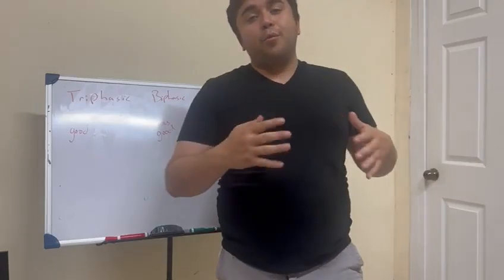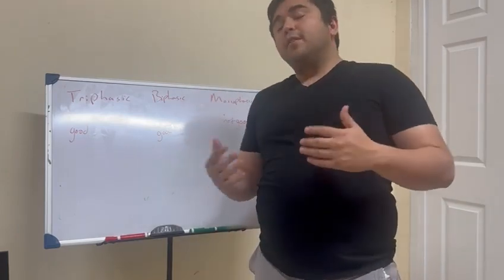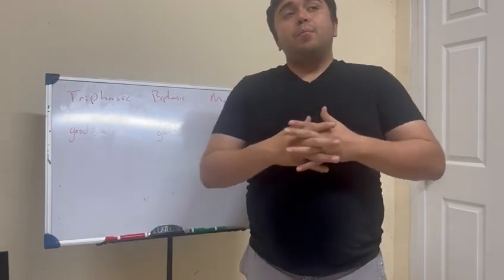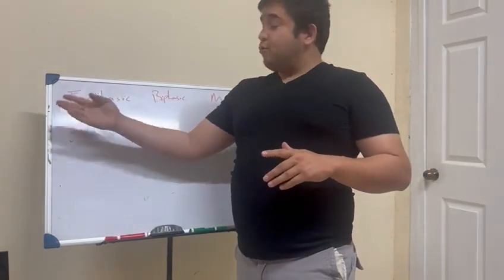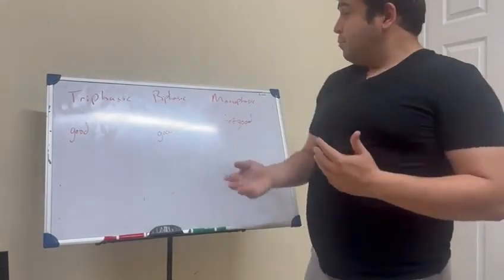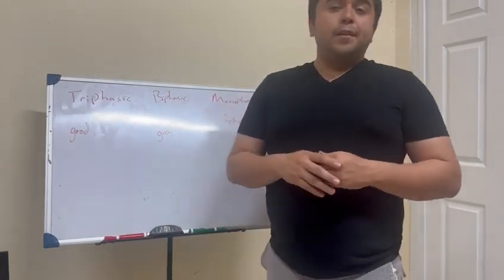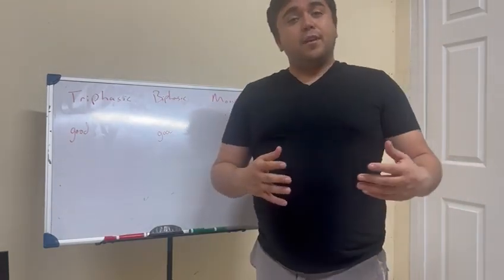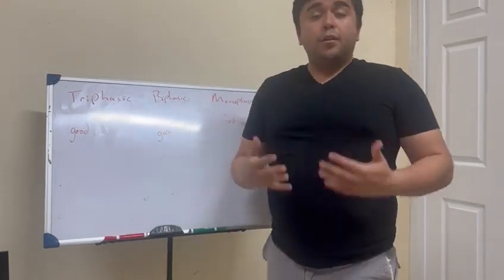So guys, these are the three waveforms that I wanted to show you for Doppler assessments, particularly in my experience for peripheral arterial disease. We went over the triphasic waveform, which is a good one. There's no obstruction. Biphasic, which is not as good, is maybe the beginning of hardening, loss of elasticity in the arteries. And then there's the monophasic, which is not good.